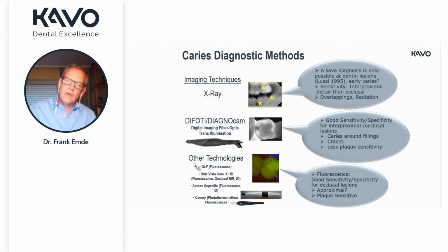However, it is questionable, especially if you use the device in different locations in your practice. If you just put the device, for example, in the prophylaxis and let your dental hygienist go through the mouth, so we check up with that, it might be debatable if this is the right combination if you want to do a dental scan at the same time. So it's nice, it works, but there is higher experience with this technology.